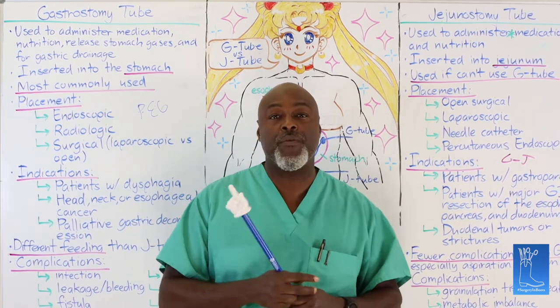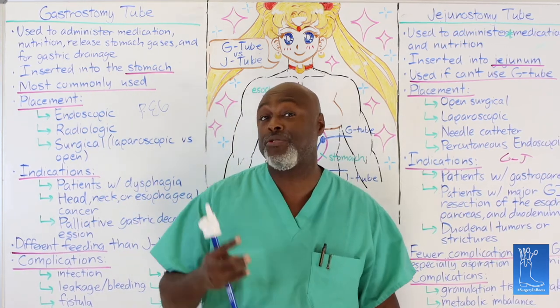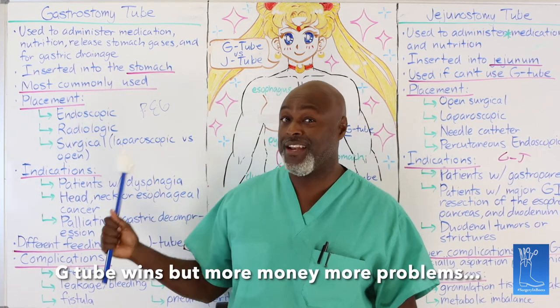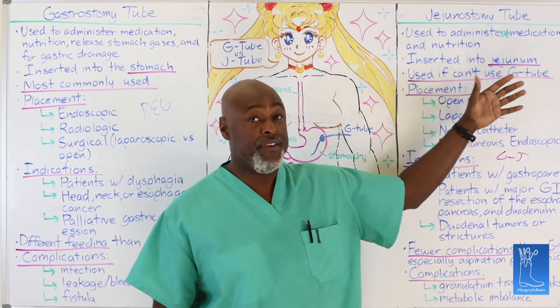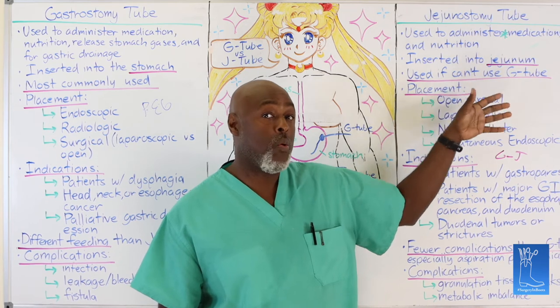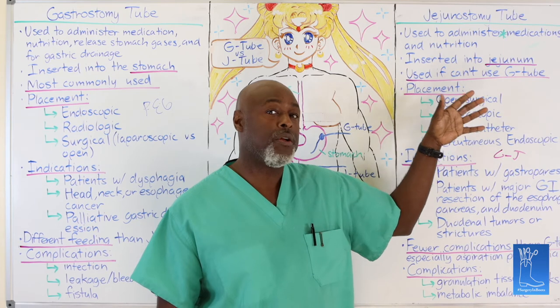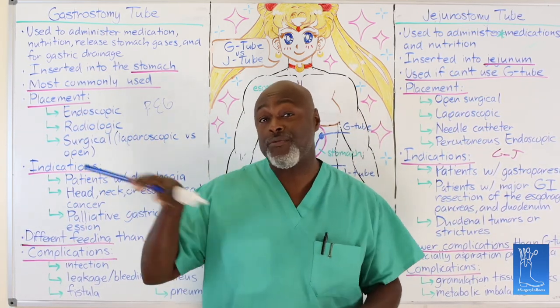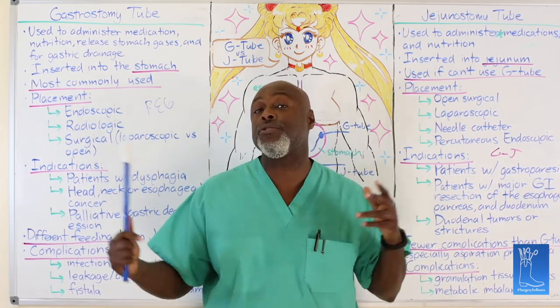Otherwise, if I had to choose one for myself, I would go with a G-tube because I can give medicine through it and have options of tube feedings. So with this one, I can give you a can in the morning, two cans at lunch, a can in the evening, and you're done. With a J-tube, unless you increase the rate of feedings, you're pretty much hooked up to this thing 24 hours a day. Or you have to change the calories, do free water, and make sure they're drinking water to be able to get out of the house. G-tube, people walk around with these, go to work, go in the bathroom, dump a can in at lunch, and keep it rolling.